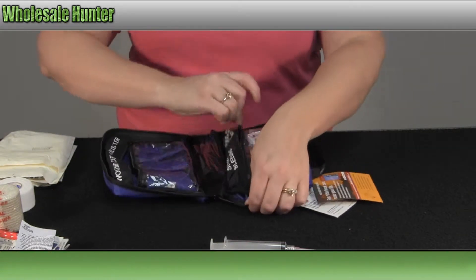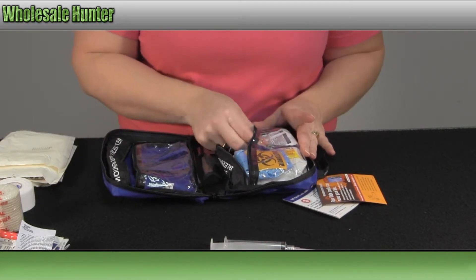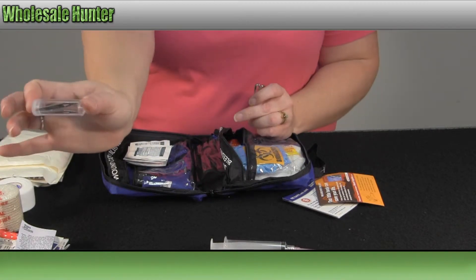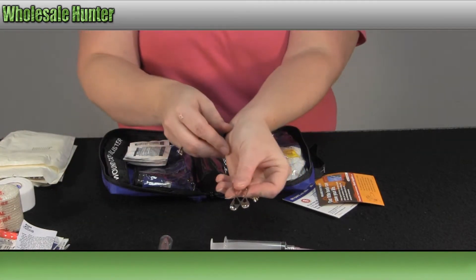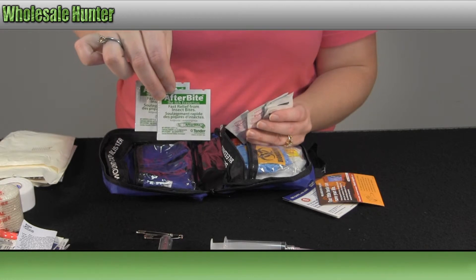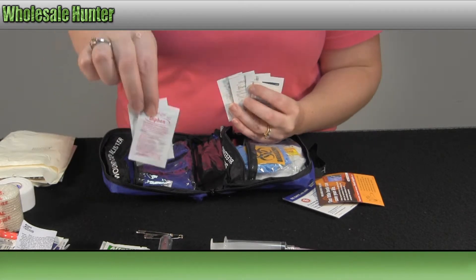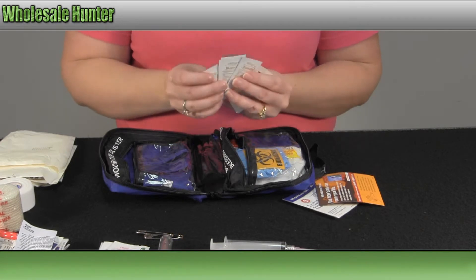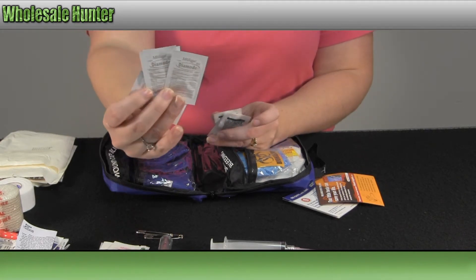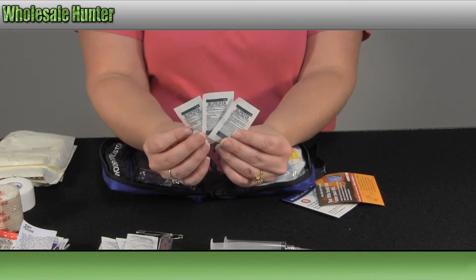Over here on this side, in your medication and instrument side, you're going to have a pair of forceps or tweezers, two of your large safety pins, your afterbite sting relief wipes, two of your allergy medications, four packages of your nausea stomach irritant medication, and three packages of your ibuprofen.